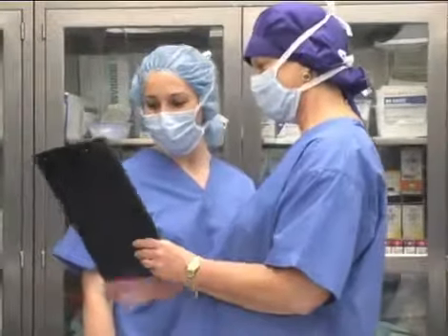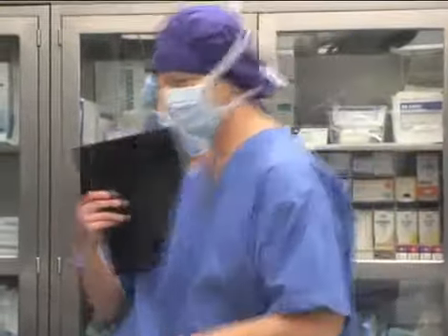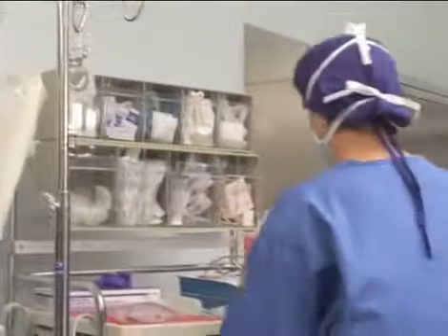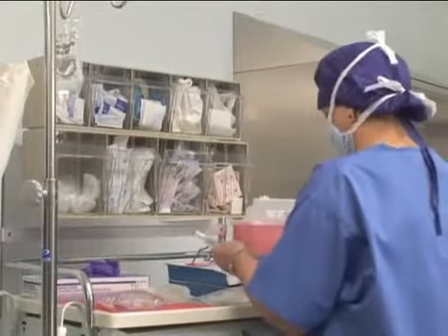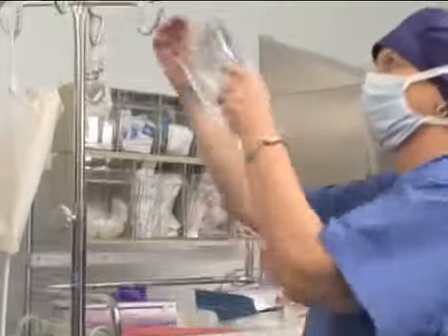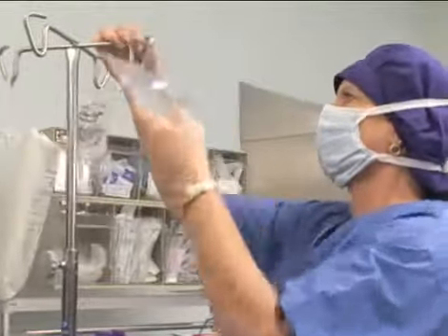Gather diagnostic studies, such as radiographs, magnetic resonance images, or other data the surgeon needs during the case. The anesthesia care provider assembles monitoring equipment and other accessories, such as cardiac leads, airway equipment, compression devices, and warming and cooling blankets. If power equipment is to be used during surgery, the inline or tank gas sources must be tested and gauges set to the manufacturer's recommendations.